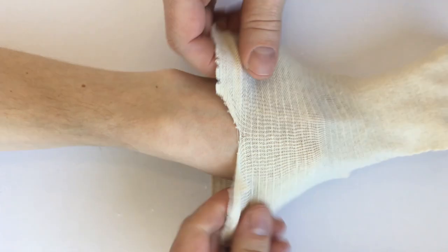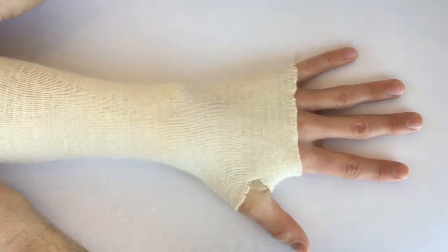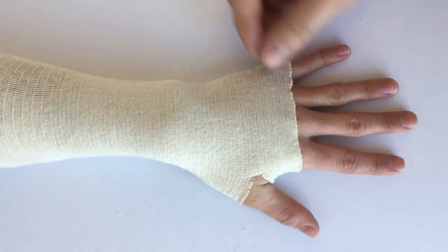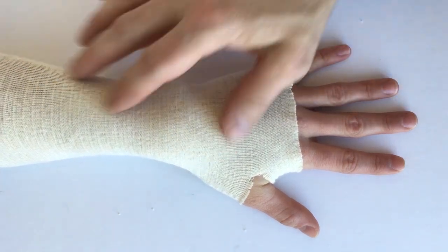Just take your tubular stocking that has some compression built into it and apply it like that. Here you can see we're getting some good compression in the hand and in the wrist.